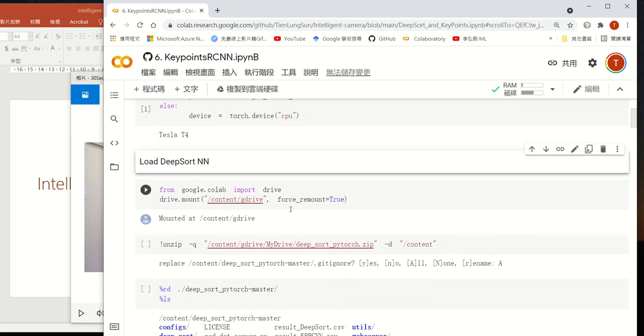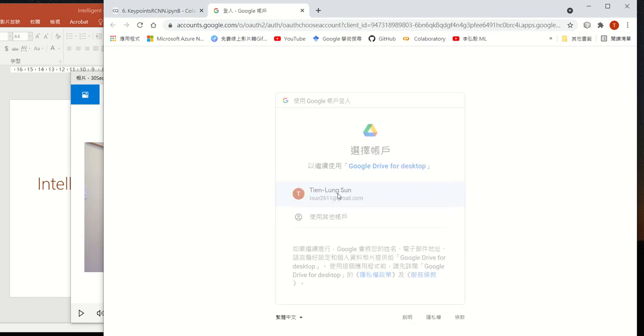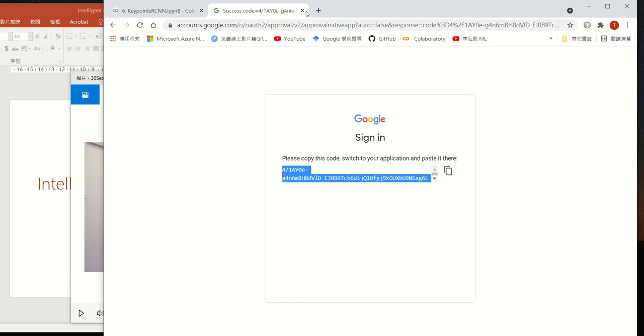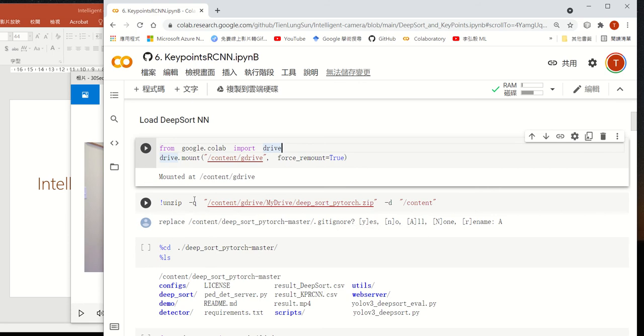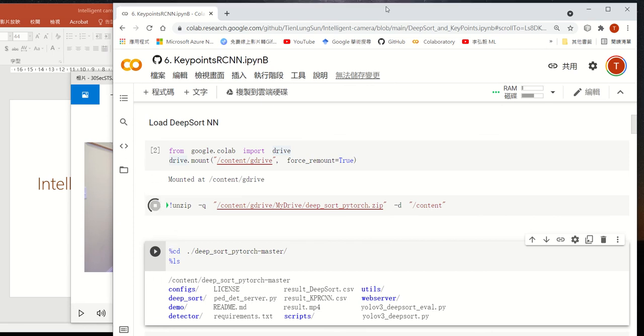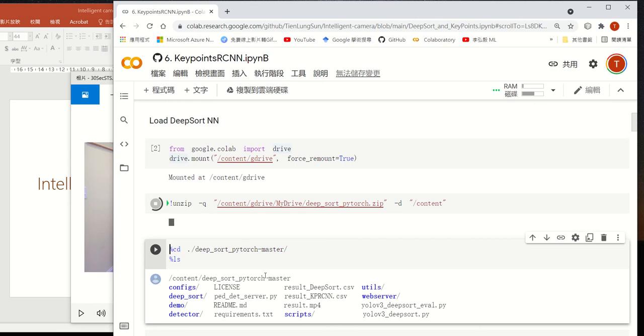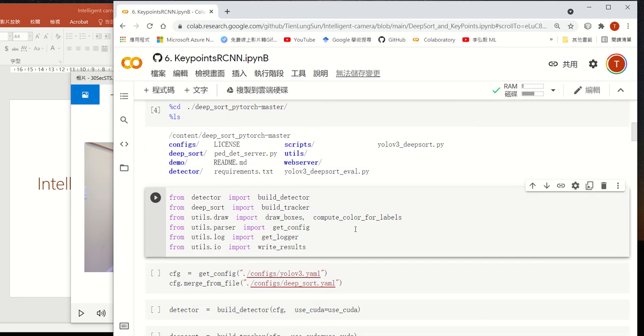Then of course you have to put the DeepSort PyTorch zip file I gave you in your Google Drive, so you can connect from Colab to your Google Drive. Just copy this authorization link and paste here, hit enter, then you will connect. Now we are going to unzip. Don't unzip it yourself; we will unzip inside the Colab program. Of course, if you run your own program in Anaconda, then it's okay. But here I assume you don't have any Python installation on your computer and you still want to try.